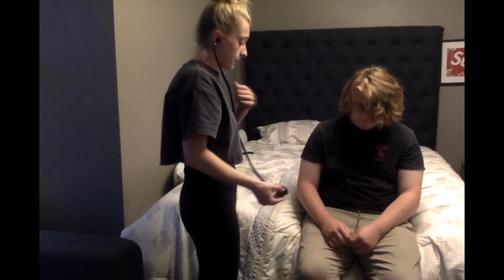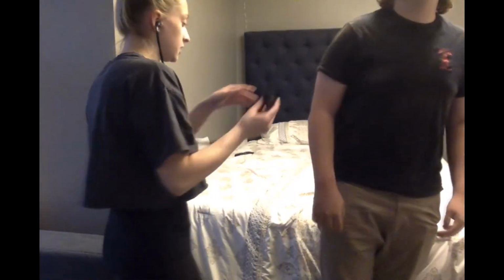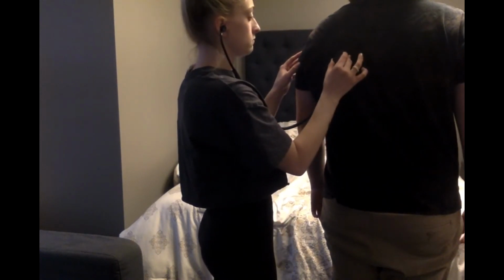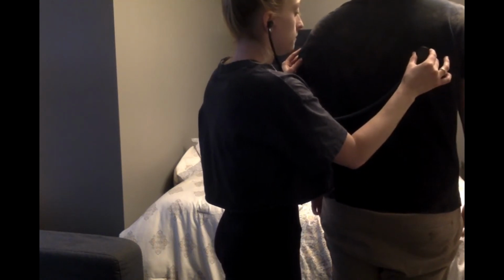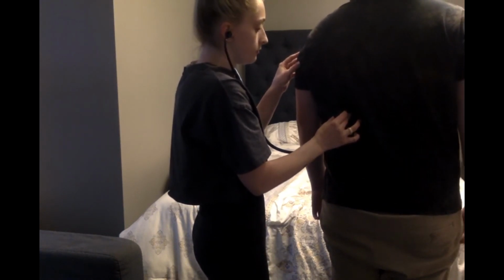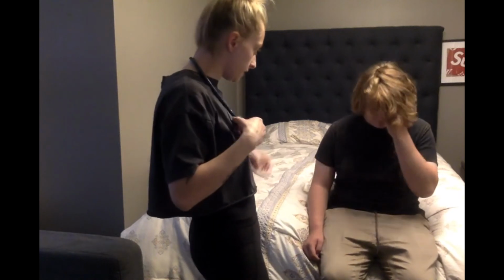Okay, good. Now I'm going to have you stand up so we can see. Turn around. So we'll go right here, and it's important that you don't go over the scapula. Breathe in. Okay, good. So I didn't hear any crackling or anything like that.